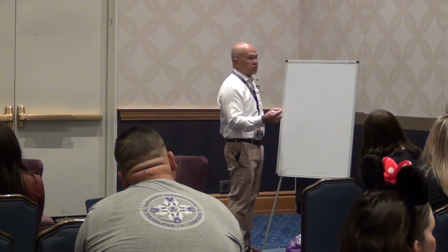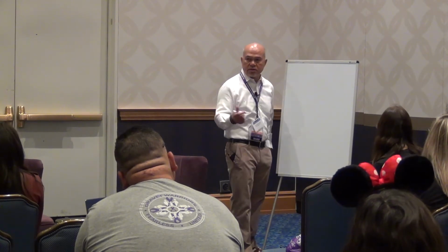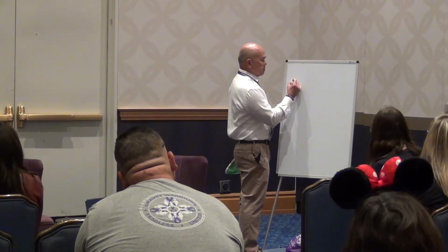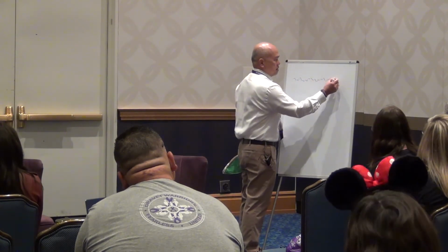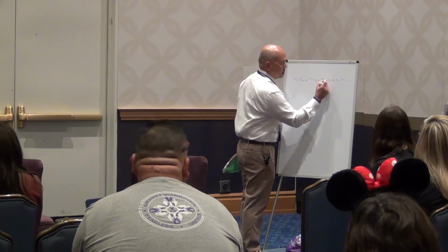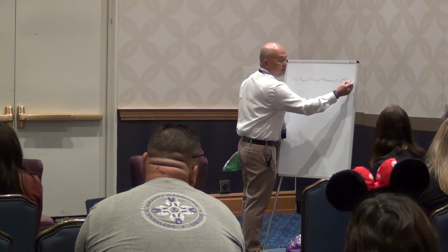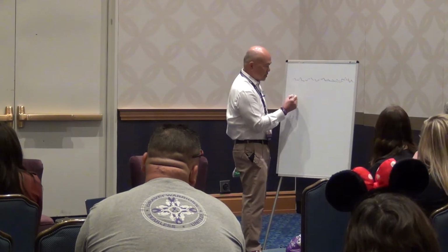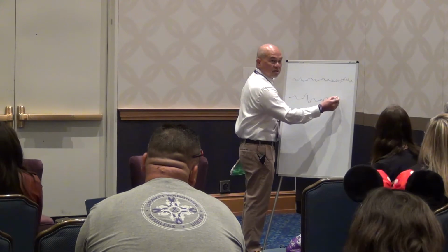So her question was, how do I know if I'm having spikes? You're not going to know unless you know how to look at EEG. But to make it simple, your brain waves look really like this, right? And sometimes it drops down in amplitude, sometimes it goes up, sometimes it slows down when you're getting sleepy or drowsy, right?